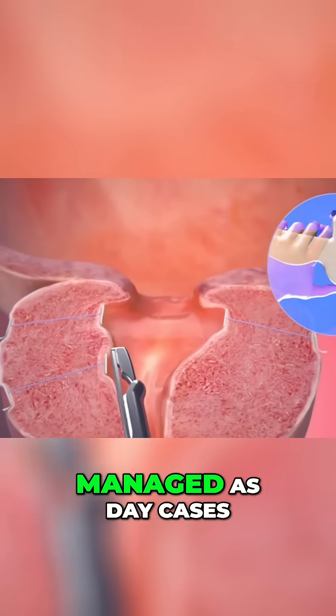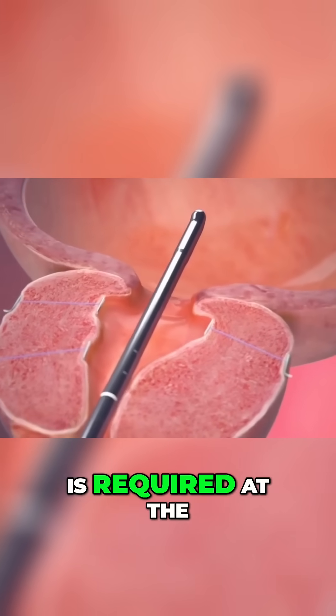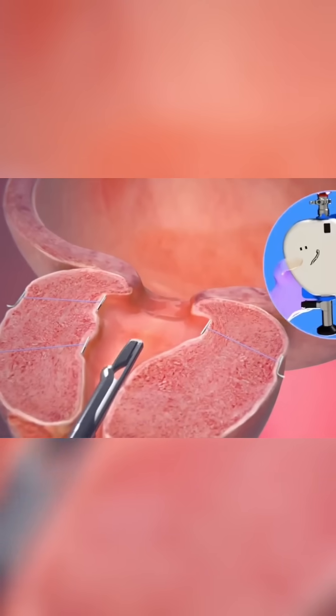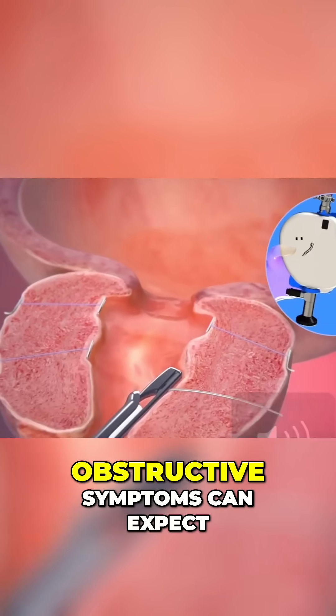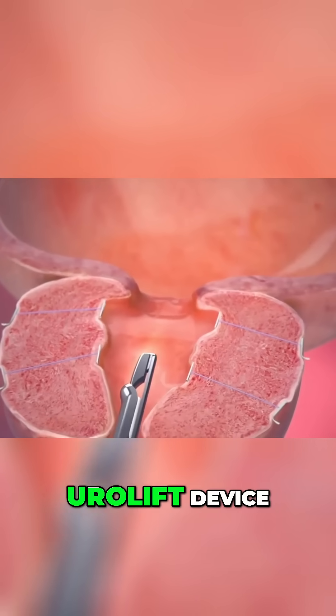The majority of men are managed as day cases and no indwelling catheter is required at the termination of the procedure. Almost immediate improvement in obstructive symptoms can be expected to be achieved with the deployment of a Urolift device.